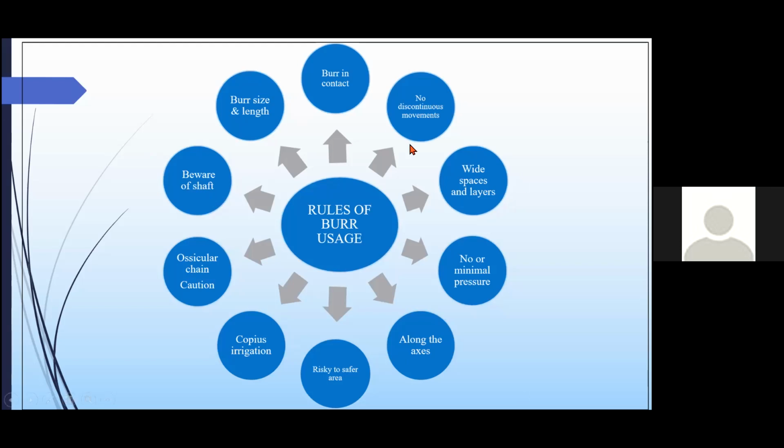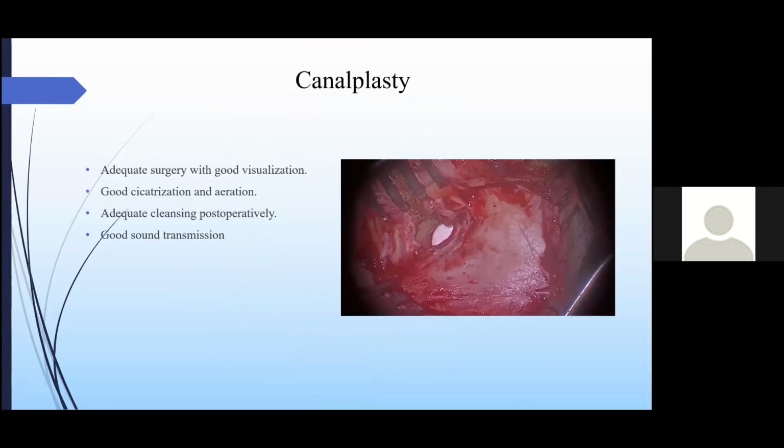So these are all the tips for the usage of the burr that we should keep in mind. Now let's start the drilling.